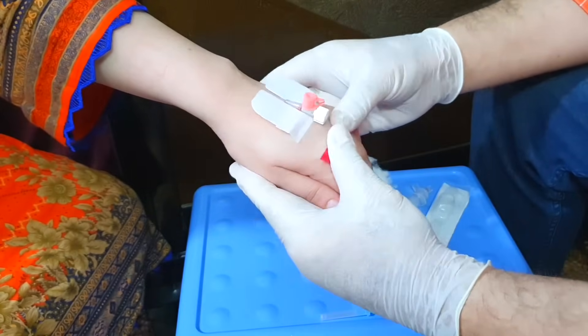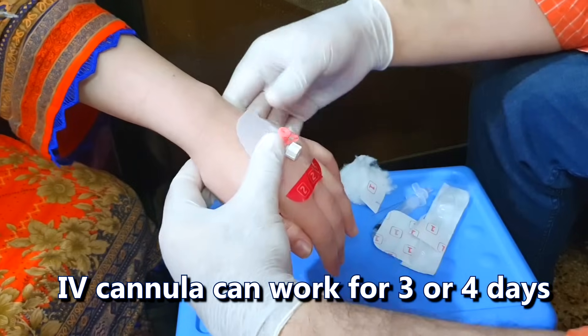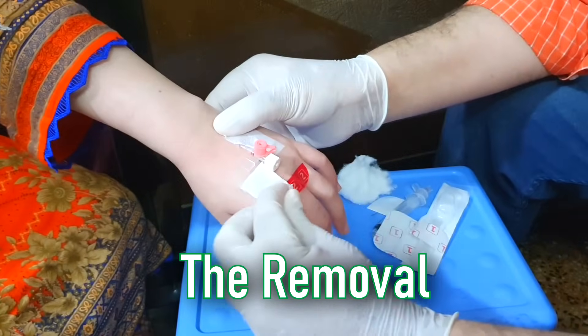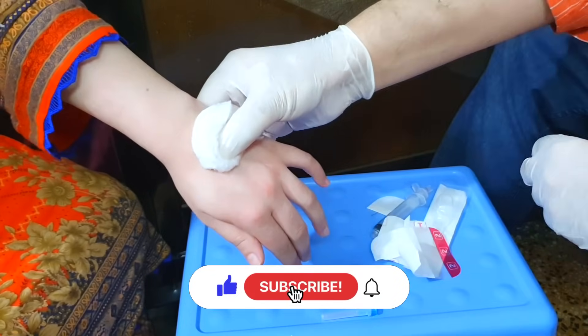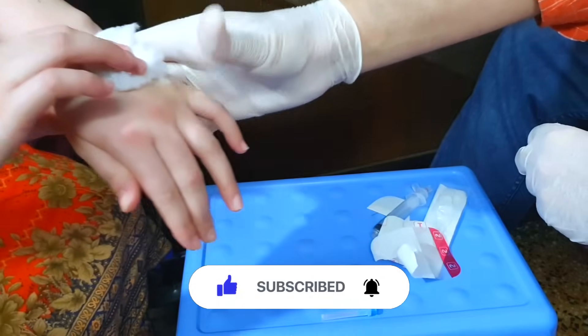An IV cannula can be left in a vein for up to three or four days. When the IV cannula is no longer required, its removal is simple — remove the fixator tape, put cotton with pressure at the point of insertion of the cannula, and remove the cannula. Ask the patient to maintain pressure on the site for several minutes. Properly discard everything.